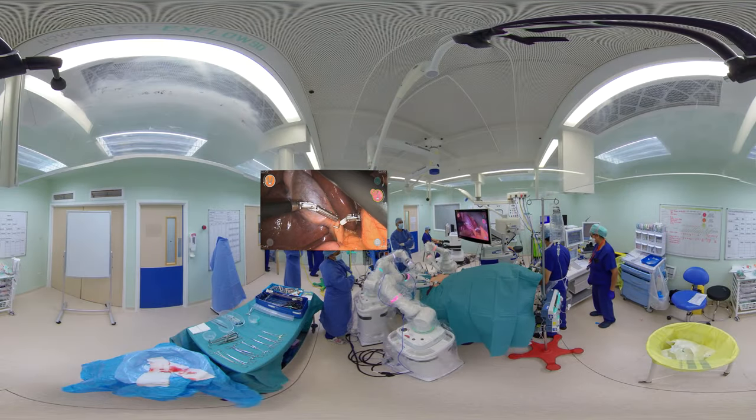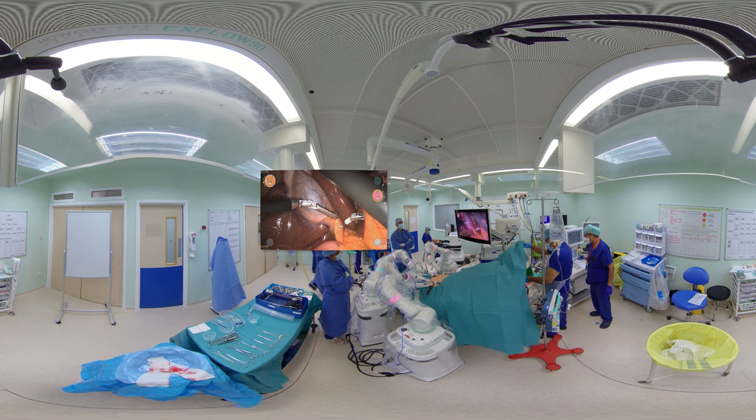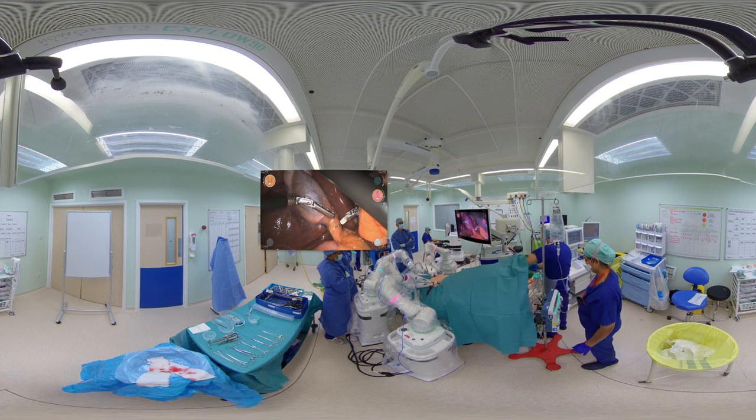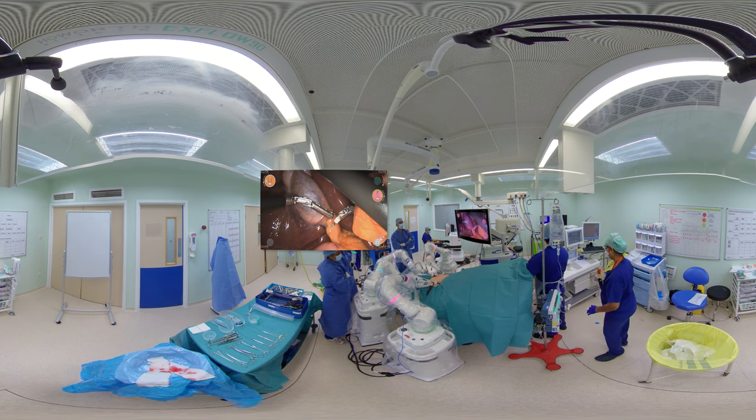We are now starting the cholecystectomy. We are using a fenestrated grasper on the left arm of the robot and a monopolar hook on the right.